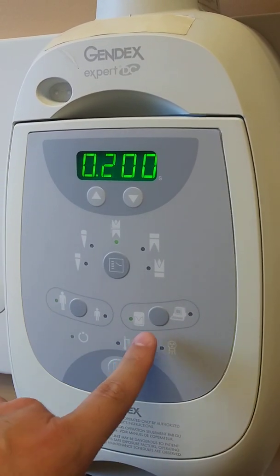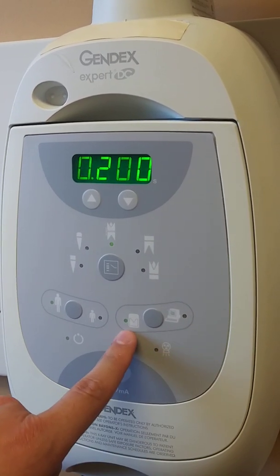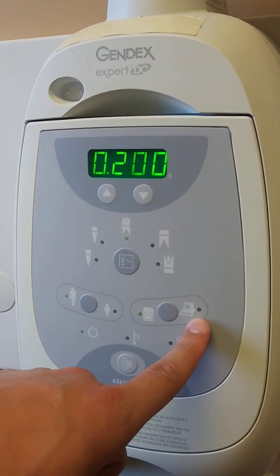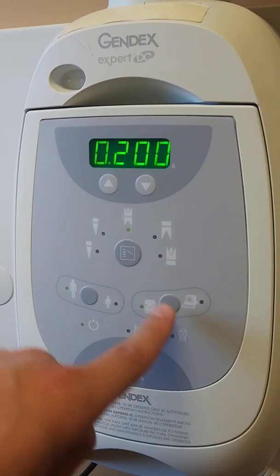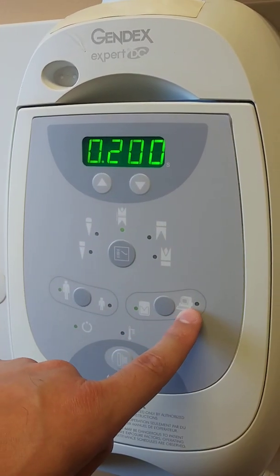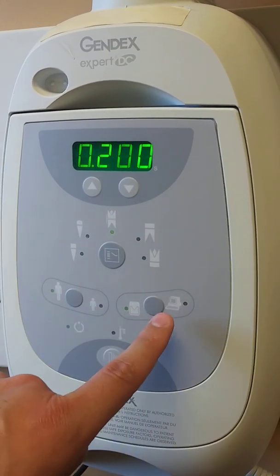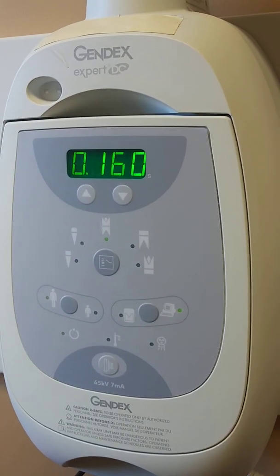I'm going to reset it back to an adult. Over here, you'll also notice the difference in x-ray types. This would be more of a conventional film or even a PSP film using the phosphorus plates. Or if you're using a digital film like the sensor, you can also use the PSPs for this one as well. If we switch to a digital x-ray on the adult setting, you'll notice it drops down to 0.16.